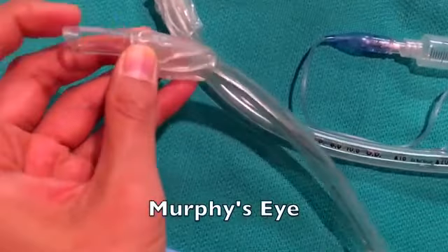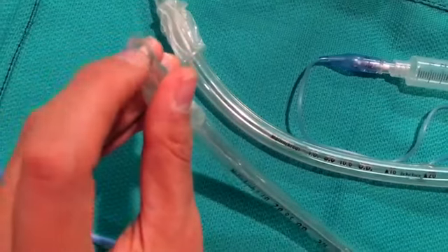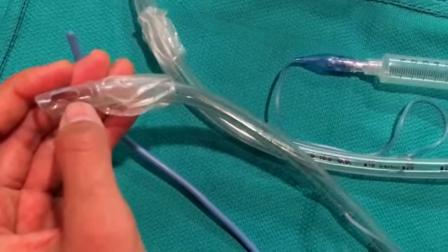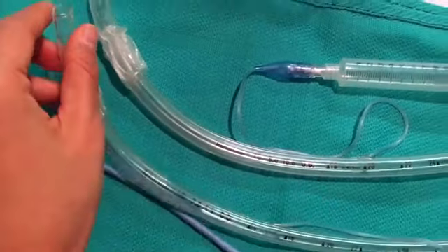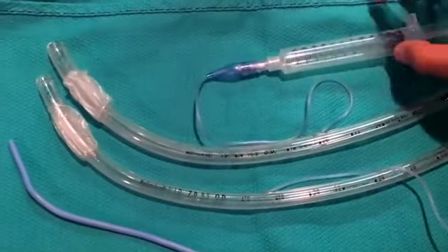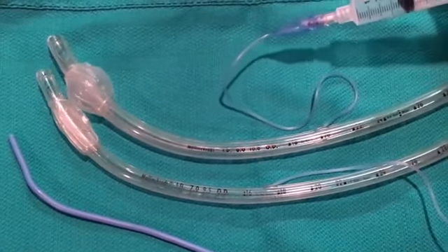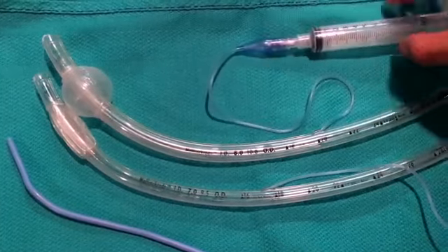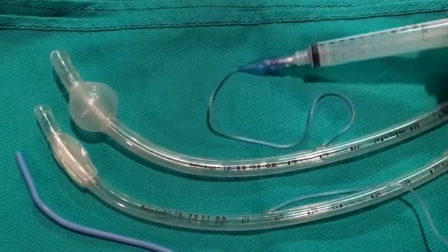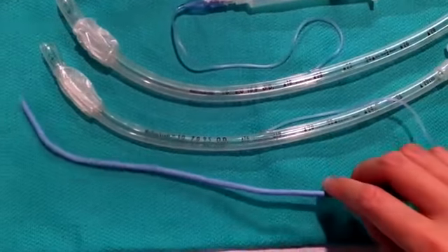There's also something called the Murphy's eye, which is this hole on the side. If something were to obstruct this end of the ET tube, it's nice to have a backup hole, and that's called the Murphy's eye. Before you insert the ET tube, you should check to see if the cuff has a leak. You do that by inflating air, and as you can see, it looks good.